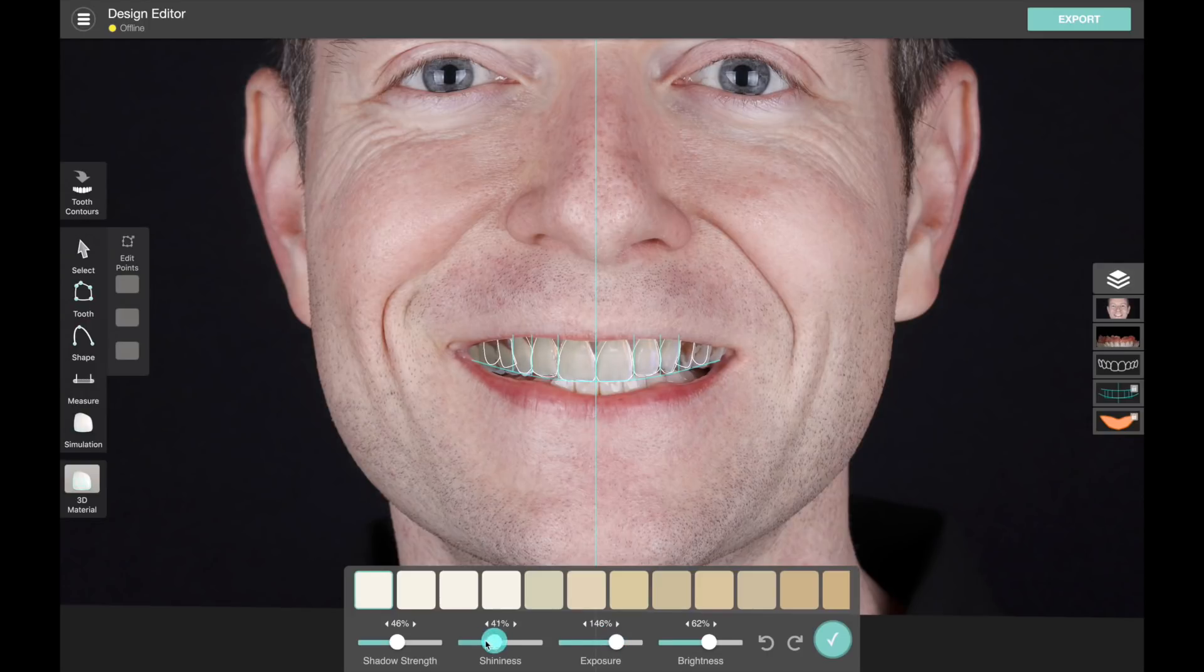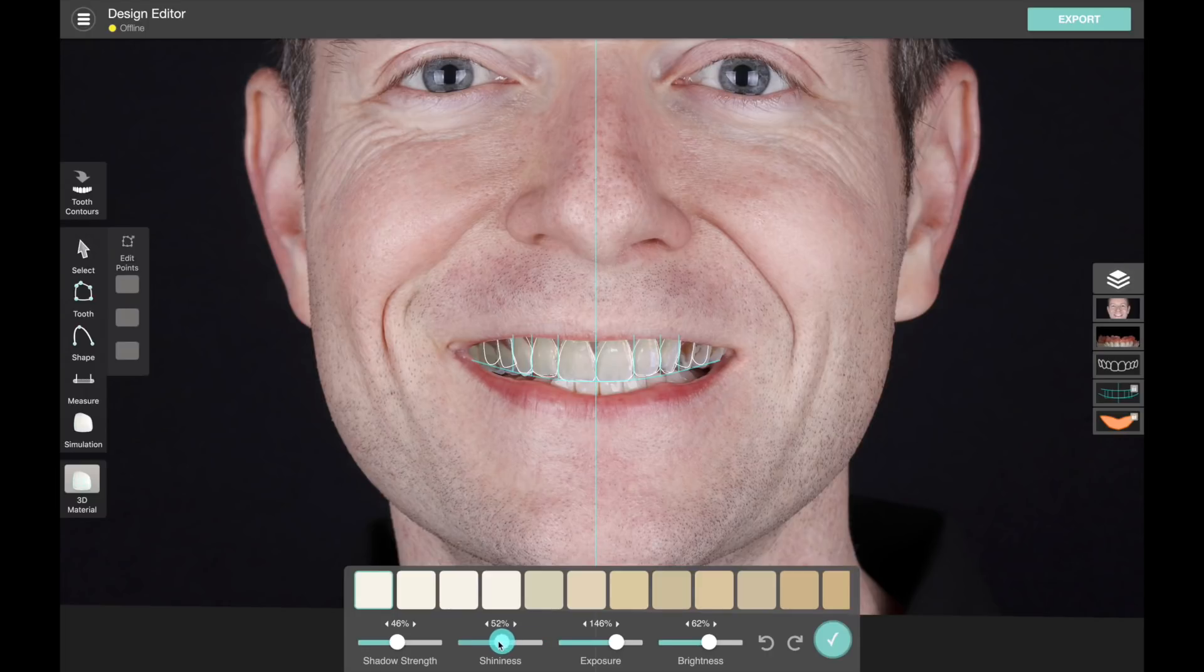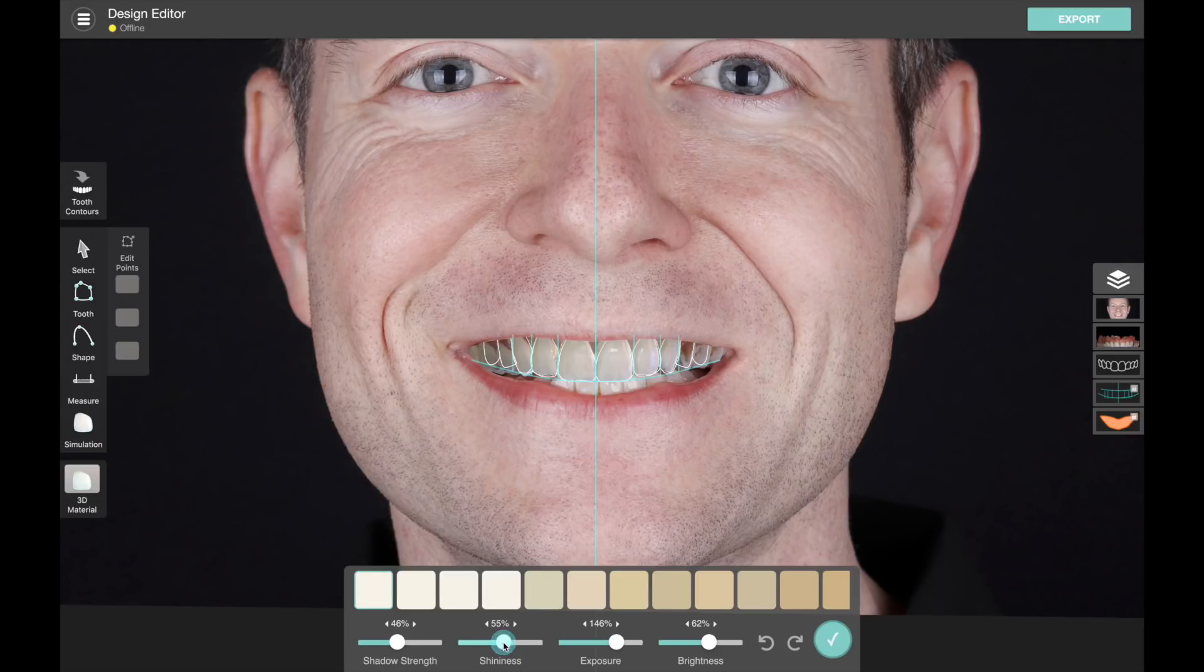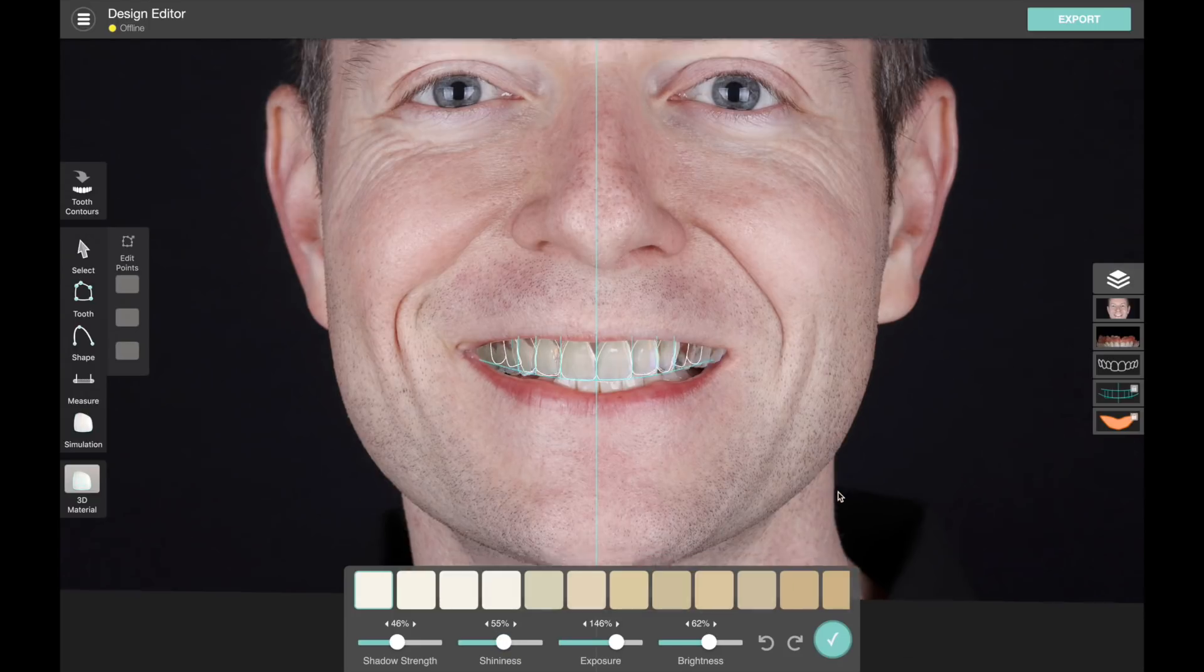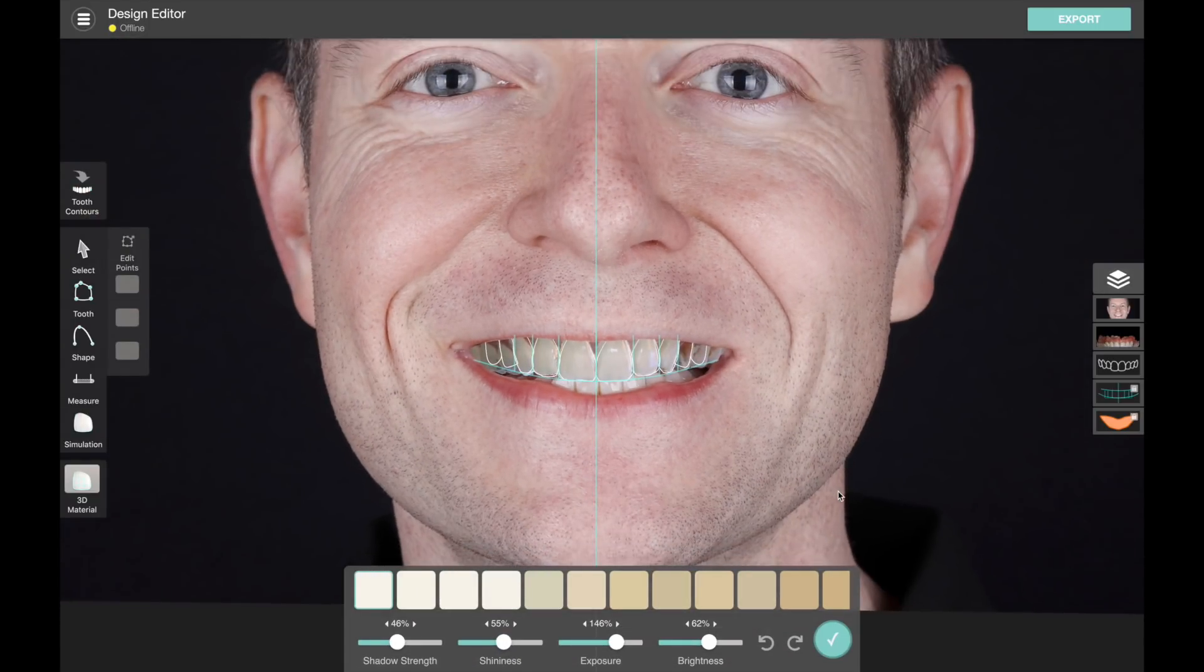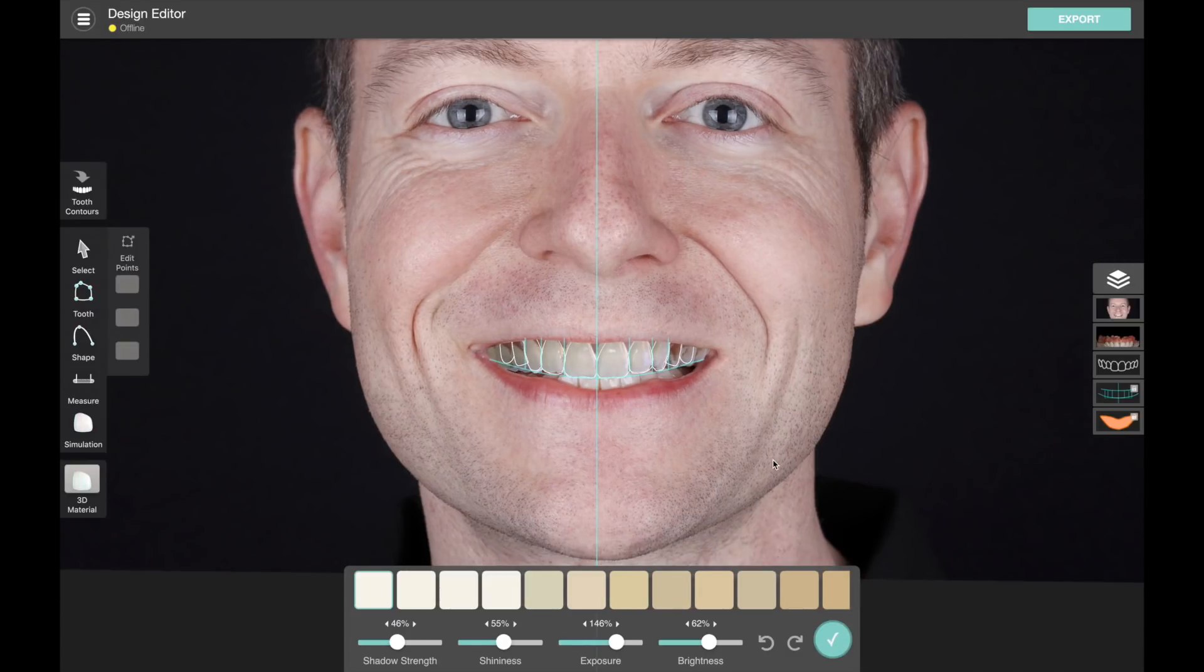And then of course we have our shininess slider, so depending on how you took your photo and you want it to match up, you can make the teeth have a lot of reflections or no reflections. So the idea of the 3D material here is just to make it look nice and integrate with the photo a bit better.